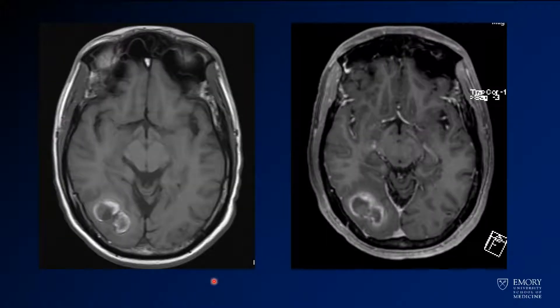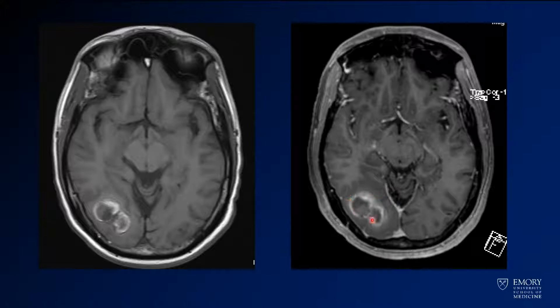Looking at more images here, what you have is an area of T1 shortening — it's pretty T1 hyperintense. You've got a little bit of surrounding enhancement around it, but it's definitely not a predominant component of enhancement.